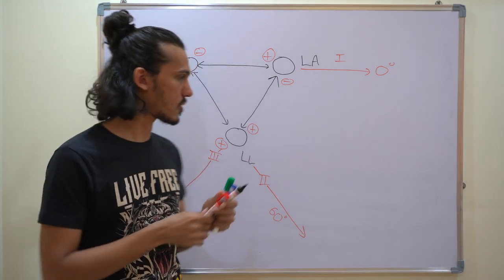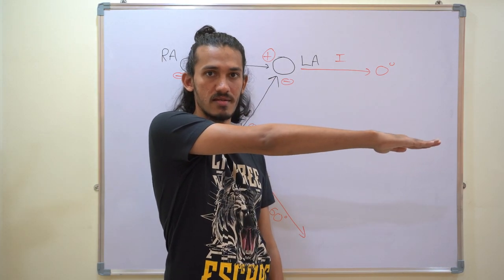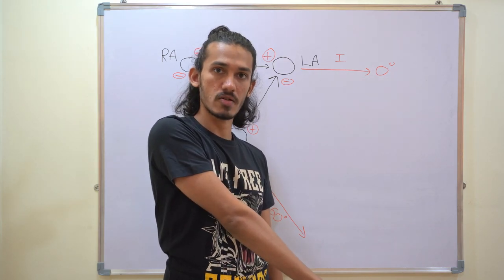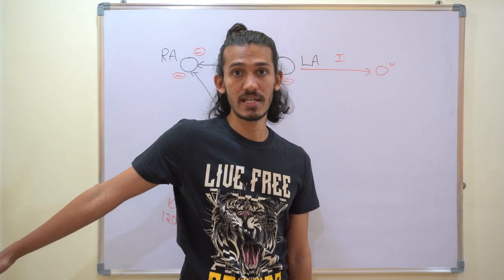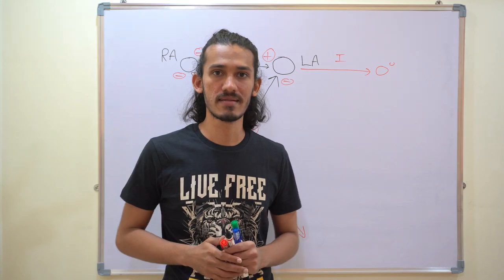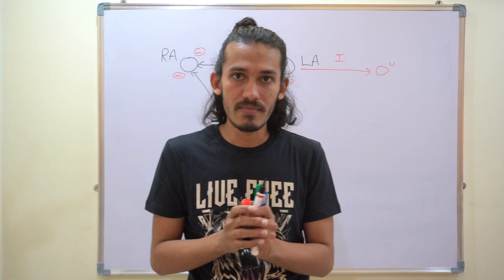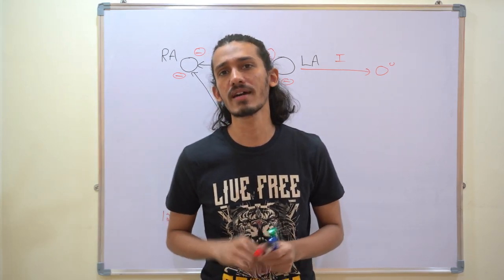You understood, right? So what this means is that in this direction, 0 degrees is the start of the circle, and that is lead 1. This is 60 degrees, and that 60 degrees is denoted by lead 2. Next we go another 60 degrees, 120 degrees, and that will be your lead 3. So these are bipolar limb leads, because there is a positive as well as a negative terminal. Because there is a positive terminal as well as a negative terminal, we measure the potential difference between them, and that is why they are bipolar limb leads. These are the three leads which were used by Einthoven.